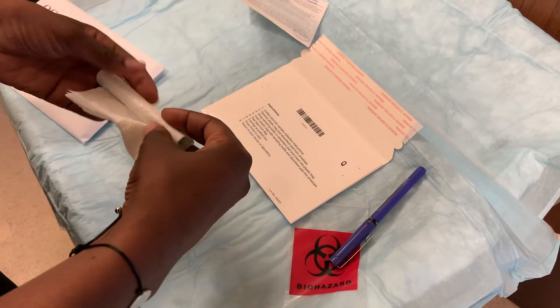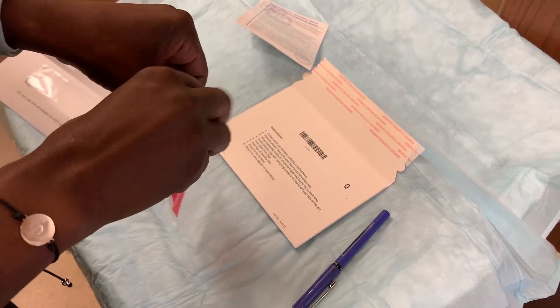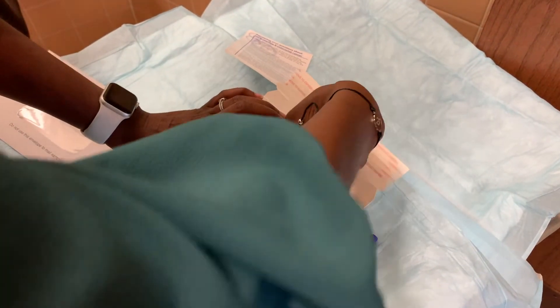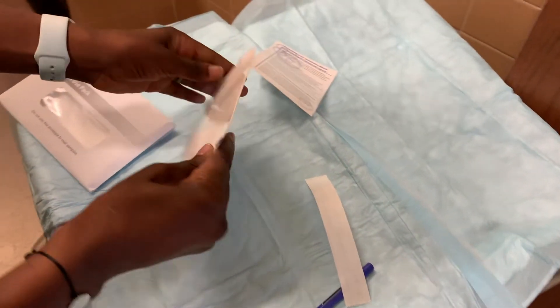Wrap it in the small tissue. Và cuốn lại vào bên trong cái miếng giấy nhỏ này. And place it in this bag. Bỏ vào trong cái túi nhỏ này. Place the bag in the envelope and seal it. Để cái túi nhỏ này vào bên trong cái bao thư và dán lại thật kỹ.